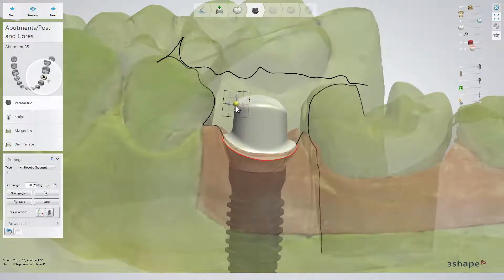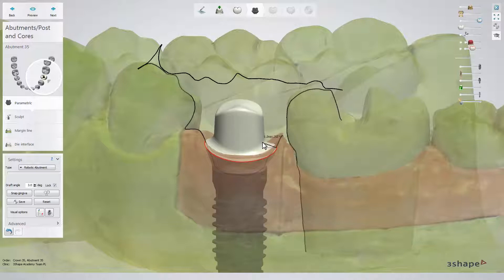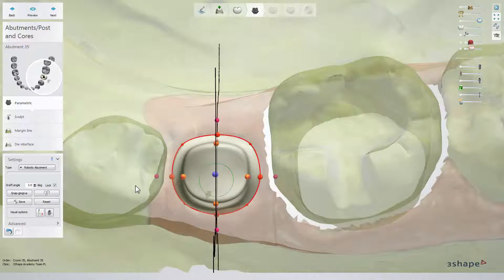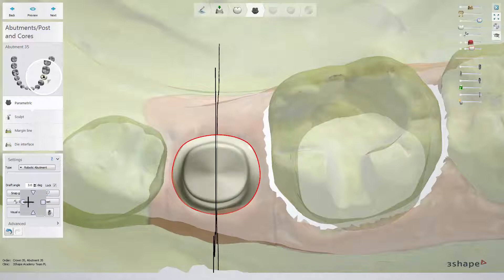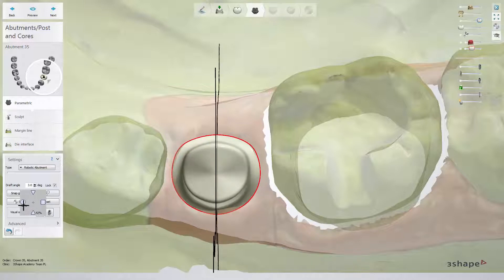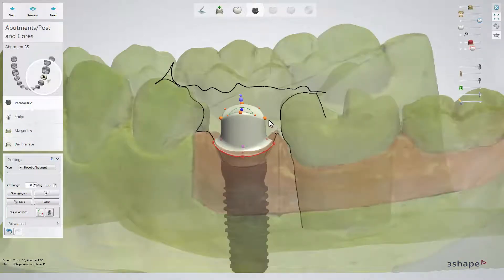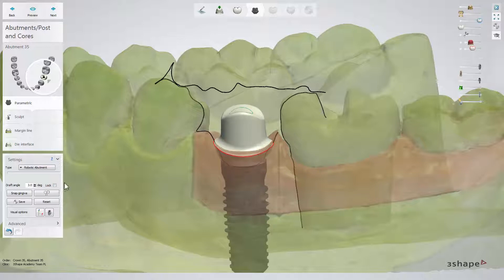Orange spheres help you to adjust the edges of the top cap, while the pink ones influence the size and angulation of the shoulder. When your basic shaping is ready, use the features available in the settings box. The Modify Margin Shape button changes the shape of the margin line between different geometrical shapes to match the margin line shape to the gingiva — keep the occlusal view when using this button. Then use the Snap Gingiva option to form the emergence profile automatically to the closest gum margin. The Draft Angle box allows you to set the angulation of the top cap walls and check Lock to keep the angulation; otherwise, angulation is prone to changes when modifying the abutment.